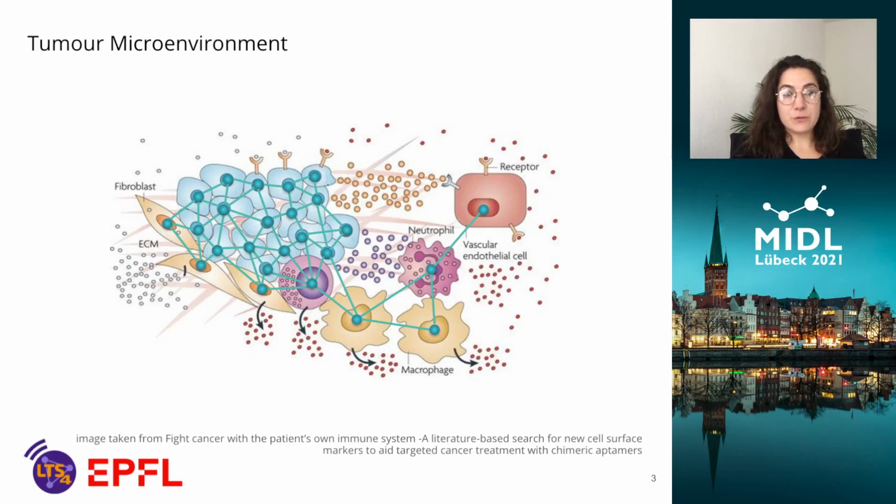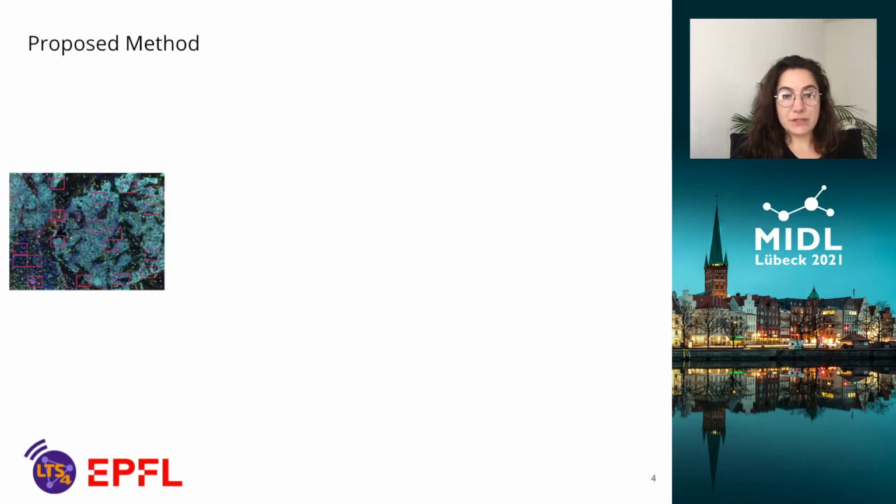In this work, we focus on a scenario where few slides are available with no associated labels, and every slide is described by cell-level analysis of regions of interest extracted from different parts of the slide, which means we have access to cell locations and phenotypes.